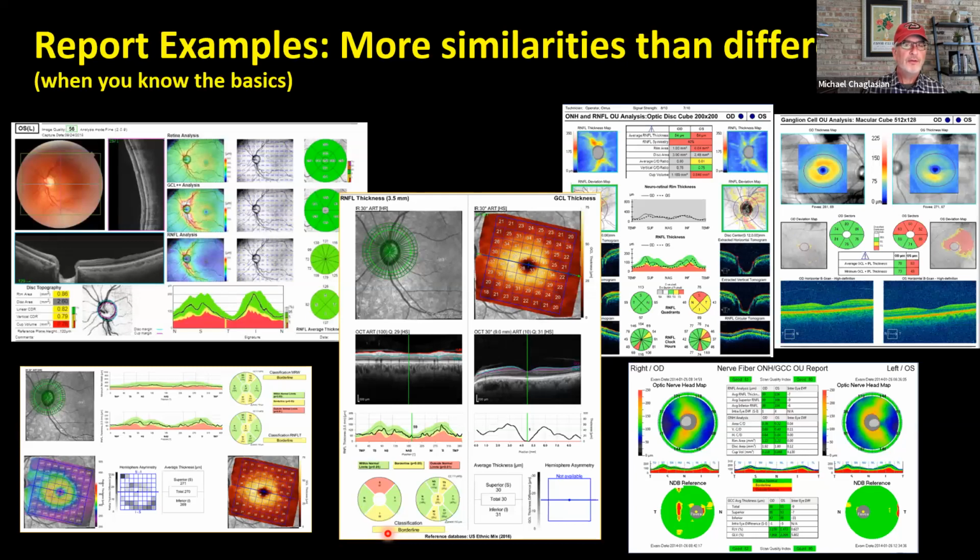So the next part is to just mention and reference that of the 67% of us that have OCT devices, we have 3 or 4 of the major different manufacturers of OCT devices, and we don't all have the same. And even if we have the same device, we may be using different summary reports from the same device. So this is really a very messy area, if you ask me, and our manufacturers have not guided us very well. They've not identified enough commonality and agreement and consensus between what should be on a report.